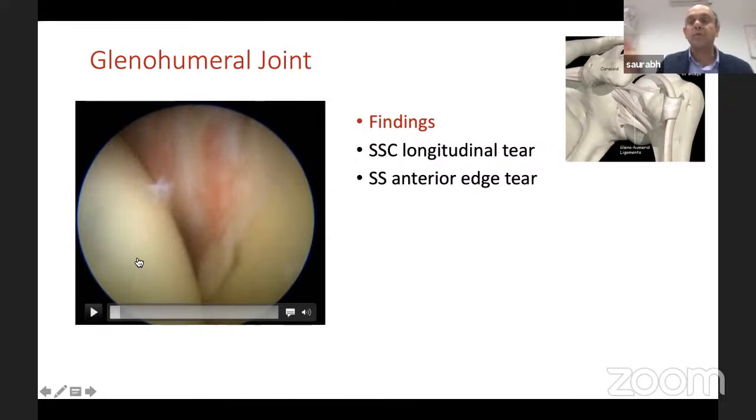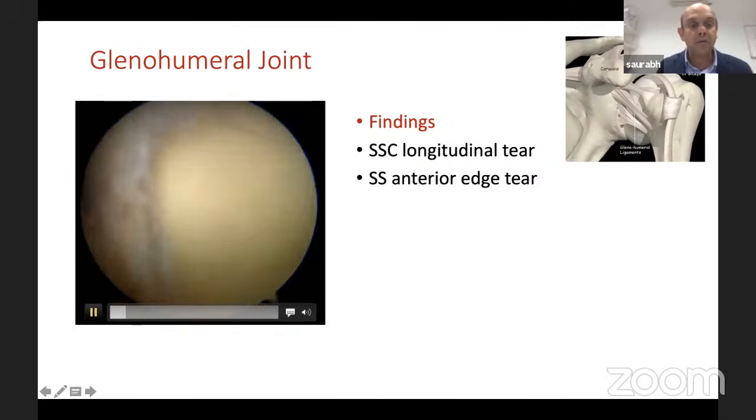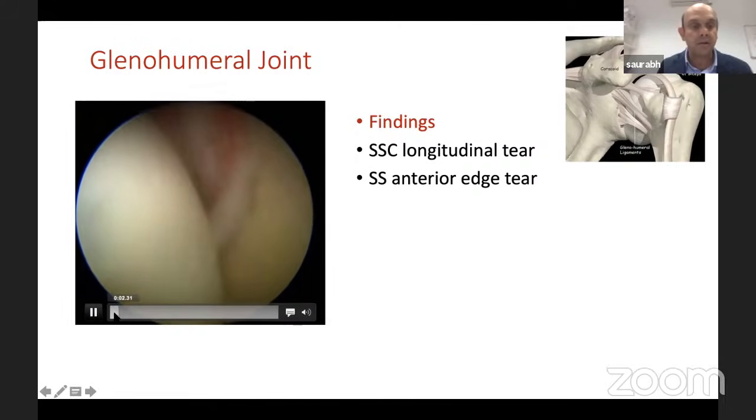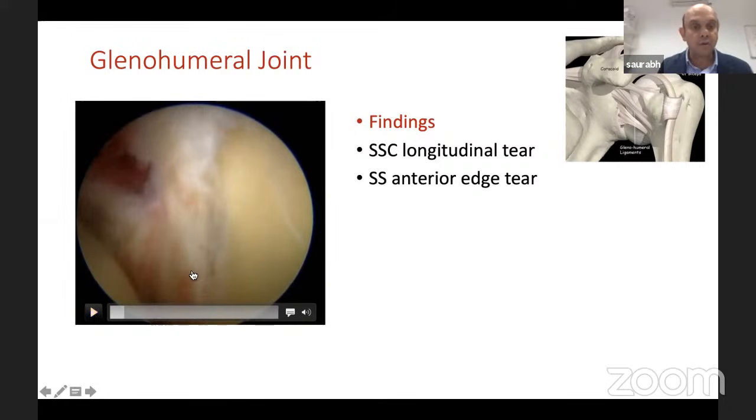You can ask your assistant to externally rotate the arm to see the whole humeral head to assess the cartilage. And then you also assess your anterior labrum at the same time, the whole entirety from superior to inferior. So you can see that's the whole labrum, which I'm pointing now. This was a normal foramen, which is a normal variant, which we'll discuss in the coming slides.